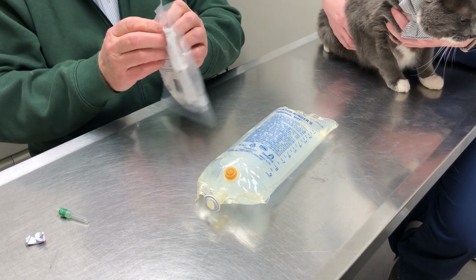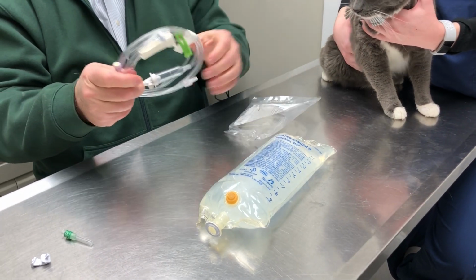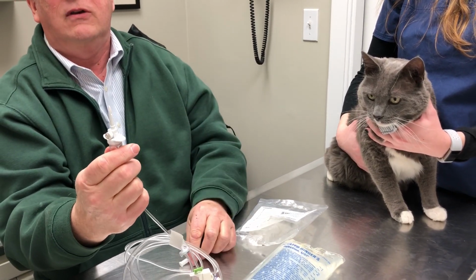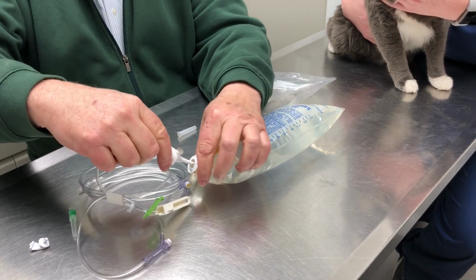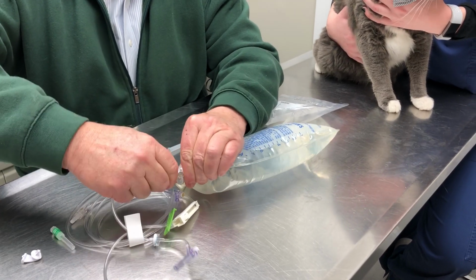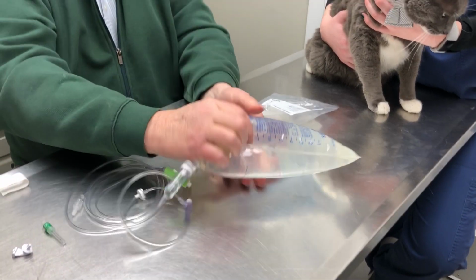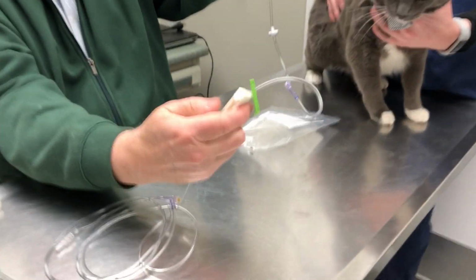Then we're going to take our IV set here and open that up. And we're going to see this big end here. We're going to take this plastic cover off, and you can see the sharp end there. That's going to go directly into the IV bottle, and we're going to push it firmly into the bottle. It's fairly snug, but it goes right in. And then we're going to show you how, so that this is the open and close for the IV.